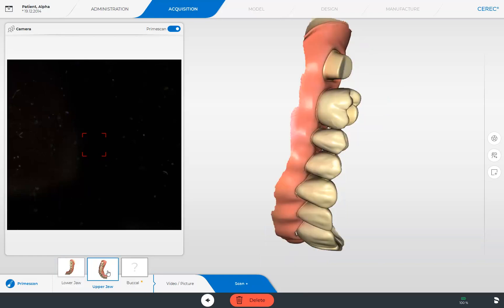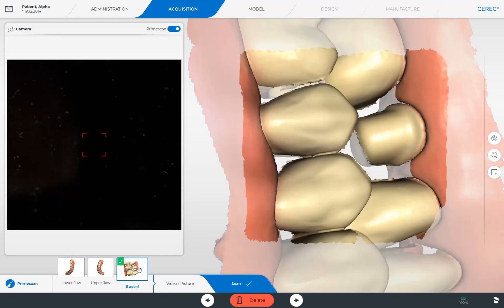Finally, we will perform the scan for our buccal image catalog. Within just a few seconds, the software merges the upper and lower jaw. The little green box with the check mark confirms this is done. In the case of Full Arch scans, it is possible to acquire a second buccal bite in the same image catalog.